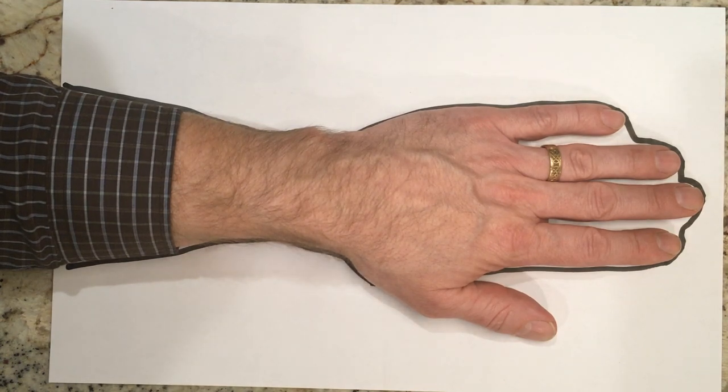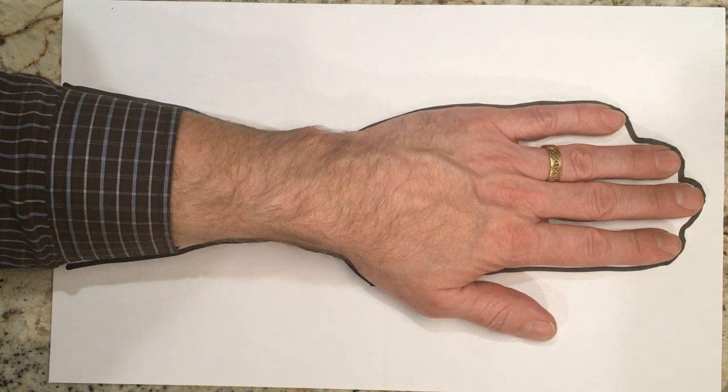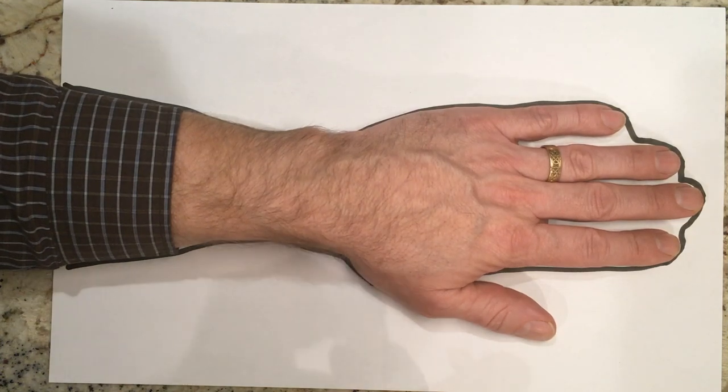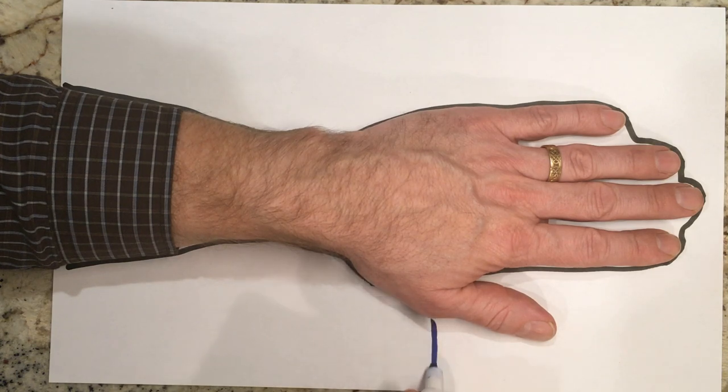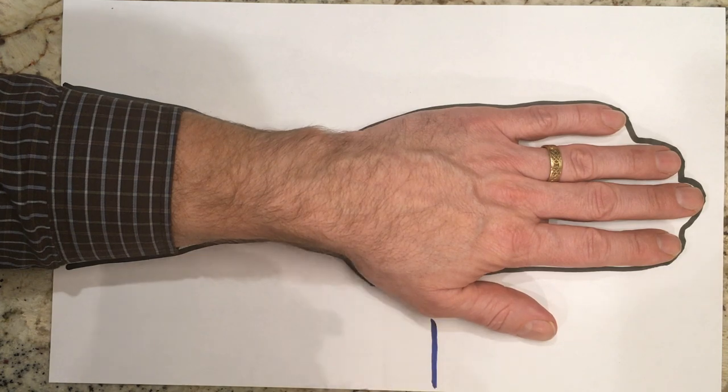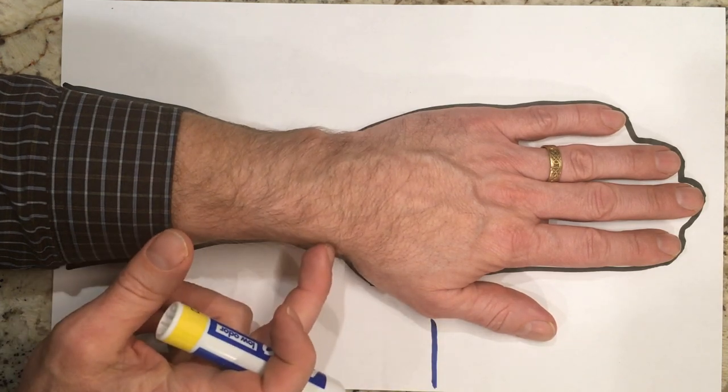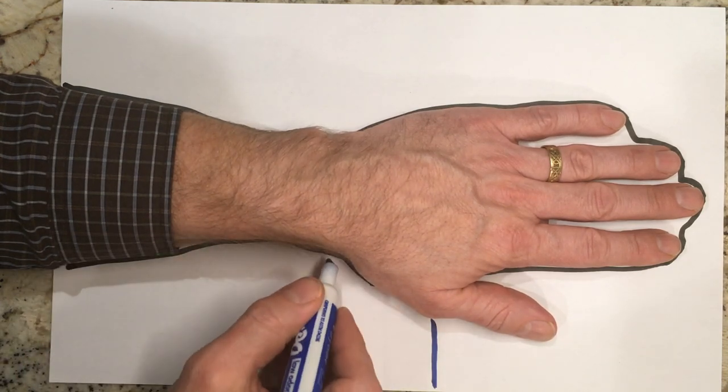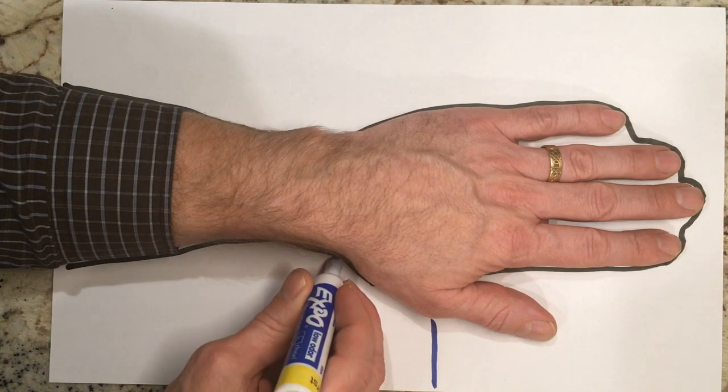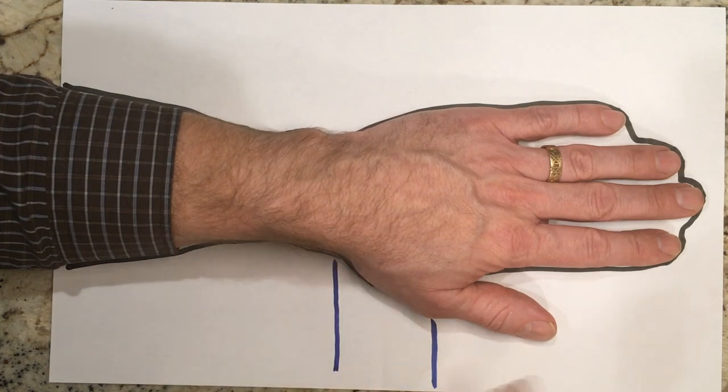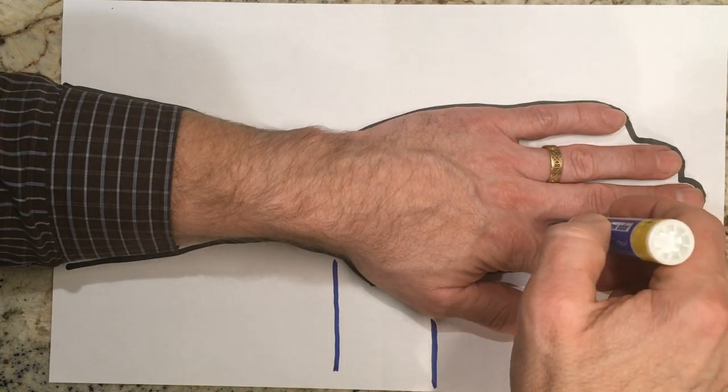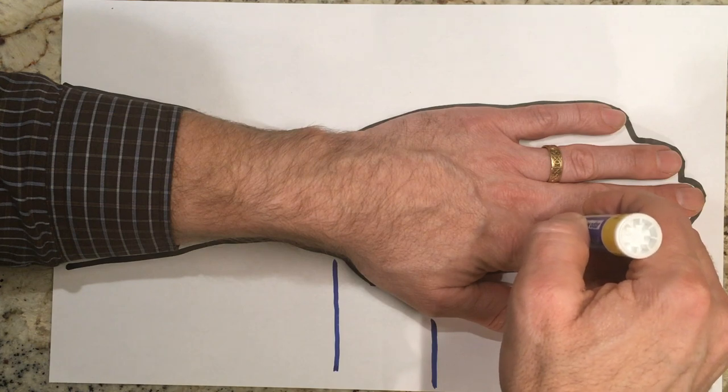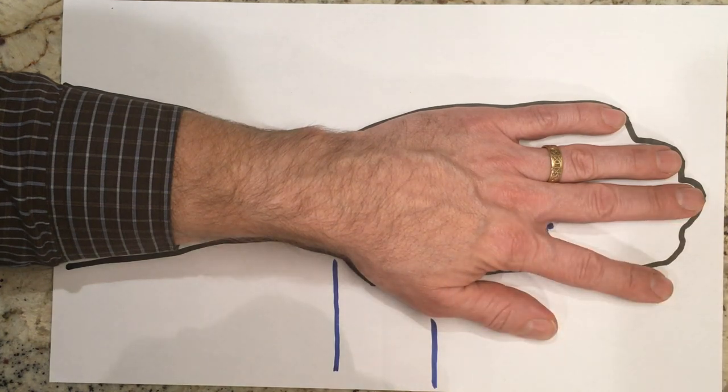Now once you've done that, you're going to draw some landmarks. The landmarks that you want to identify and draw are the thumb metacarpal phalangeal joint, the radial styloid, and the web space between the index and middle finger. Make a little dot there.